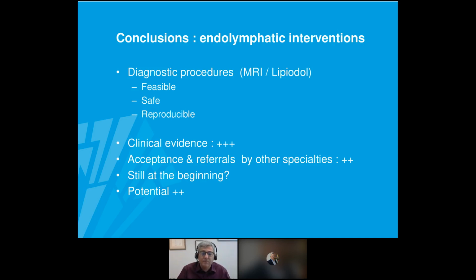And probably you mentioned that, but maybe good to remind, which needle do you use for puncture of the nodes in the groin or in the abdomen? Yeah, well, if you want to puncture the lymph nodes in the groin, I typically use a spinal needle. It's a 23 or 25 gauge spinal needle. This is more than enough. You don't use too large needles. This is a very fine needle, and that's more than enough.